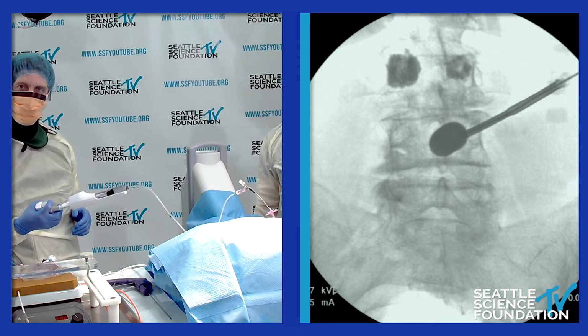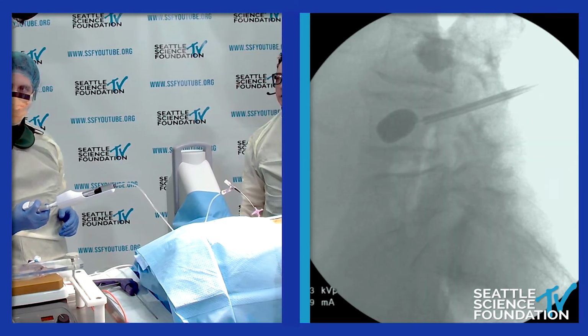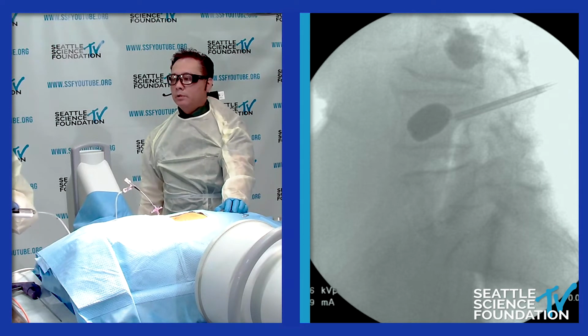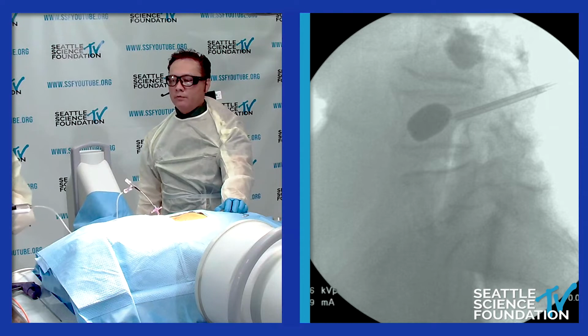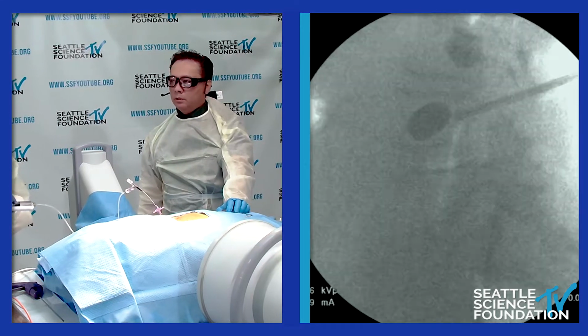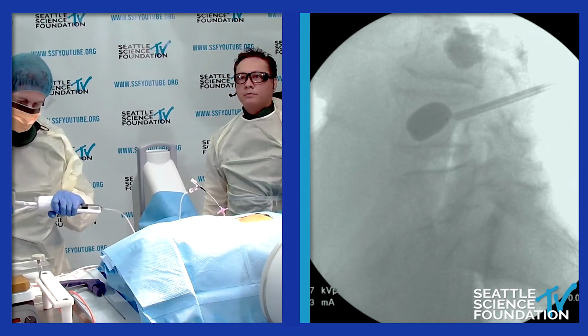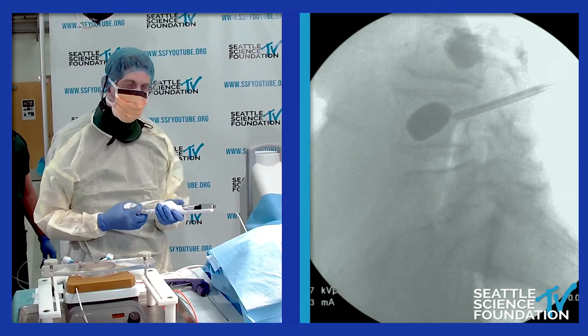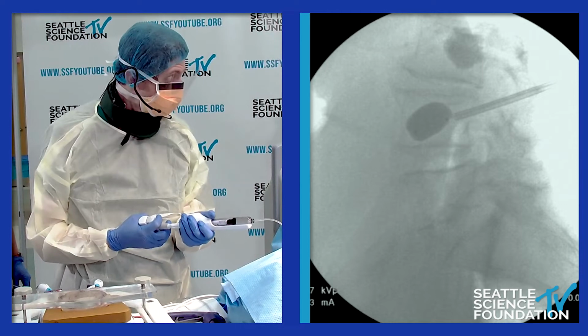Some alternatives, as I said, is using a curved needle if your vertebral body is heavily collapsed, which unfortunately one sees quite often. From 60 to 70% collapse of the vertebral body, there's not a lot of room for balloon kyphoplasty.